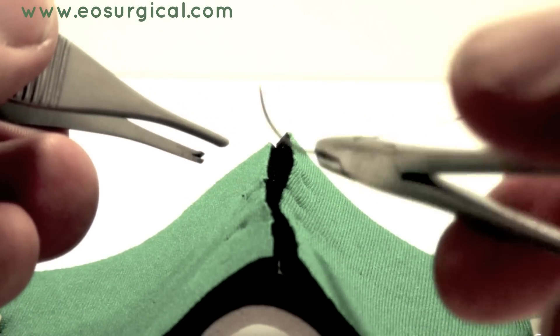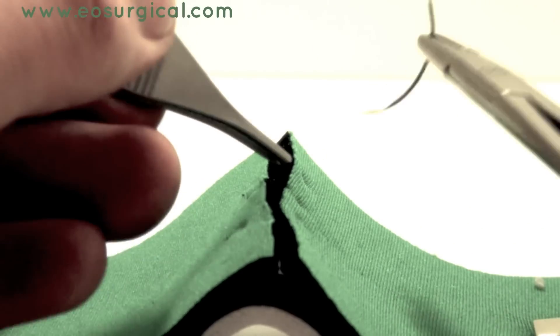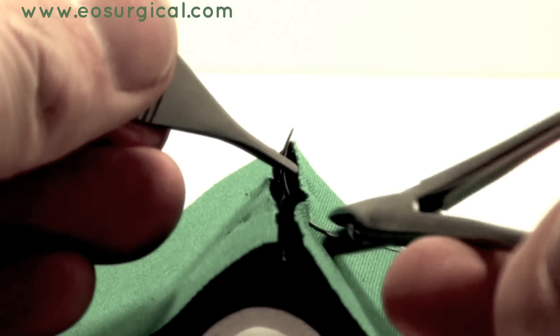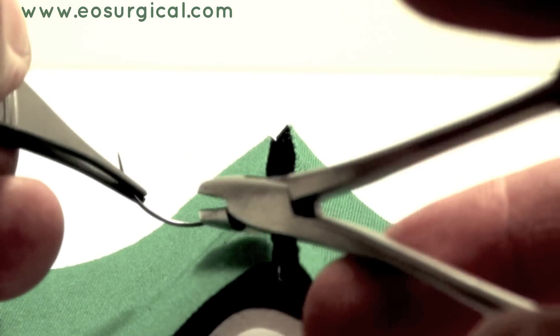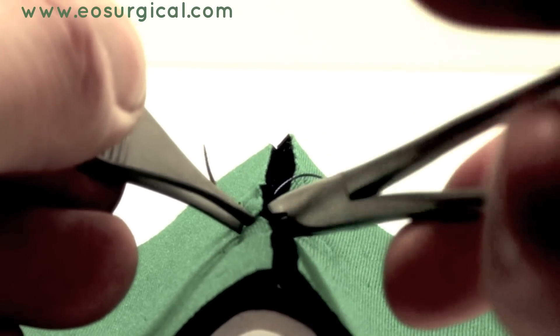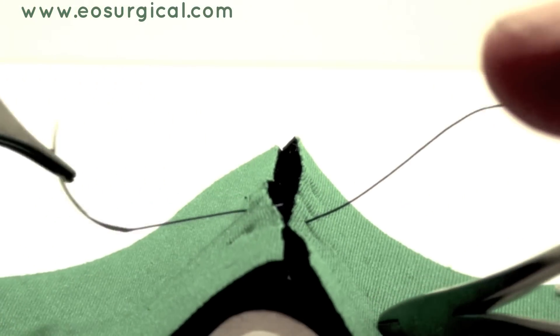Now, first of all, it's important that you pass the suture through the tissues and follow the curvature of the needle. This causes a minimum amount of tissue damage. Note how the wrist rotates through to allow this curvature to be followed.